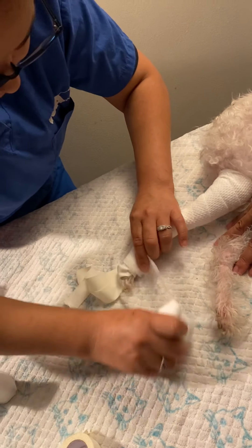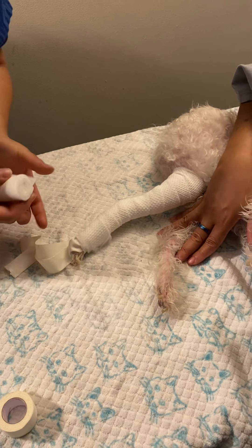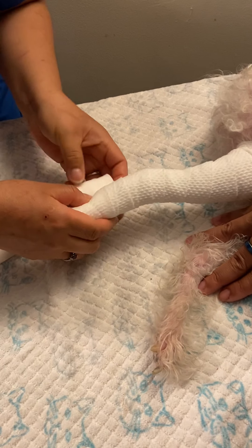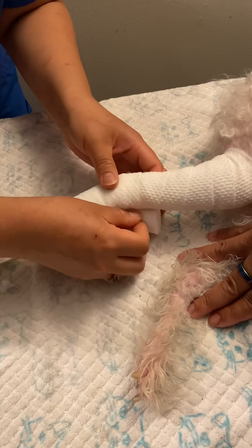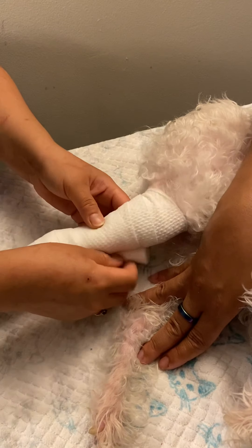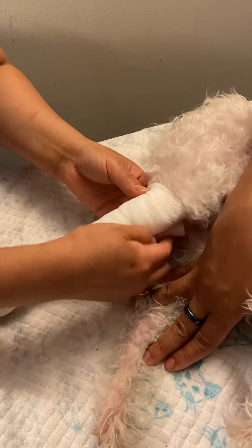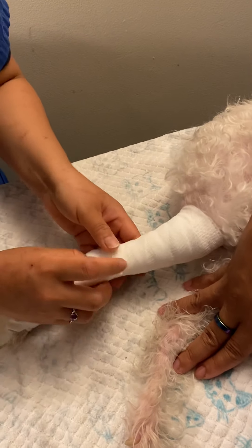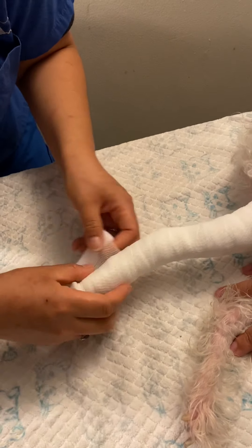We're just going to gently rip the cast padding off. Now we're going to go with the two-inch cling. This is just to secure our bandage — it's automatically going to cause some stretchiness. We're going to stretch at the end and then go up and down with this bandage, still making sure everything is even.